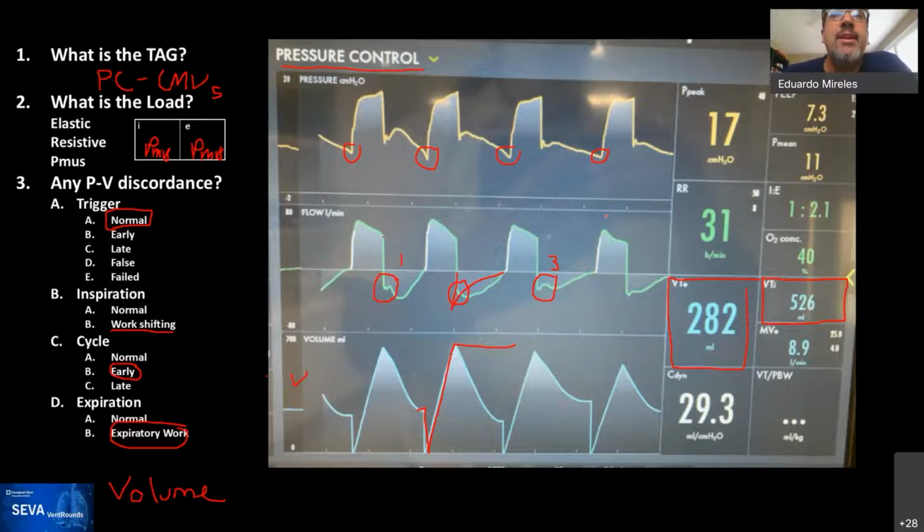Rob? Yeah, and there's this controversy about how to set the cuff pressure. You know, minimal leak technique, minimal occlusive volume, all those things. And there's a lot of, I think, confusion surrounding that. My advice is to have an automatic controller. I don't know that we can afford to do that on all patients, but that's the best way to do it. And the next best way, in my opinion, is just allow minimal leak during inspiration. So you can hear that on the trachea with a stethoscope.